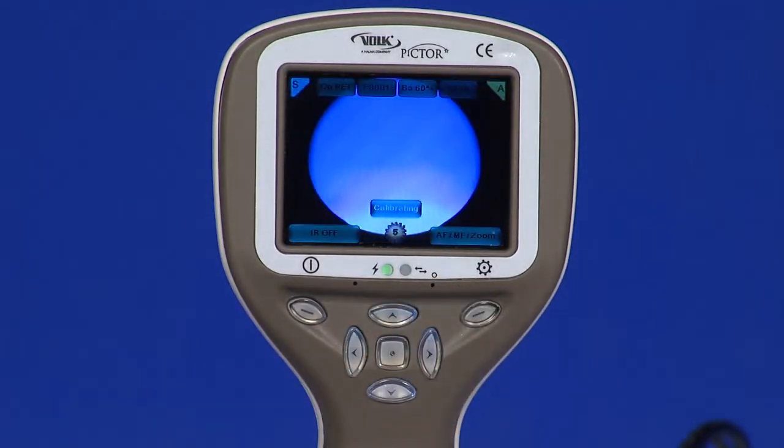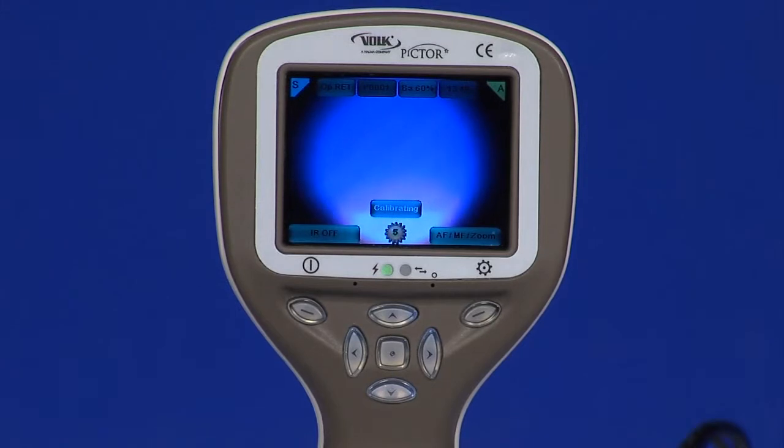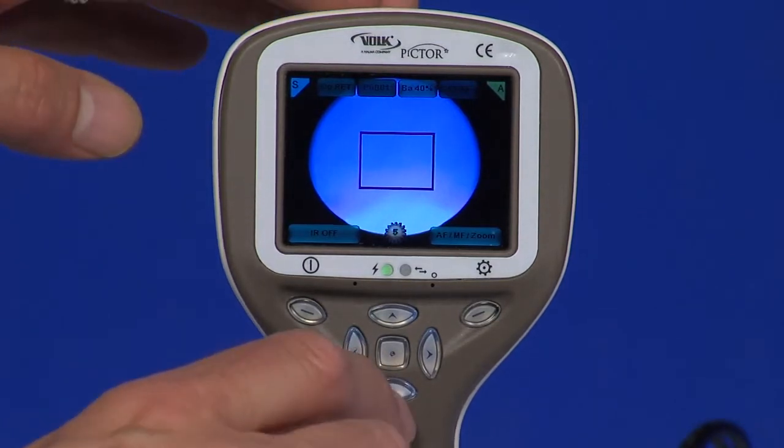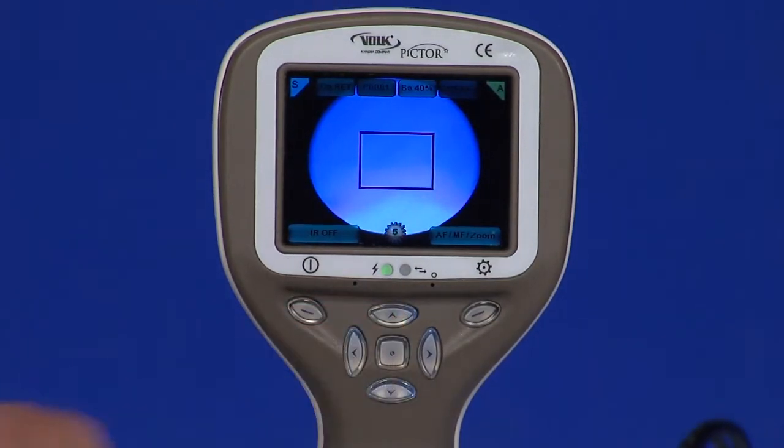Middle key. Press the middle key to activate the focus window. It is possible to move it using arrow keys to better capture the wanted area. If multiple patients are examined during the same session, it is recommended to create a new file folder for each patient's images. A new folder is created by pressing the middle key for 3 seconds.